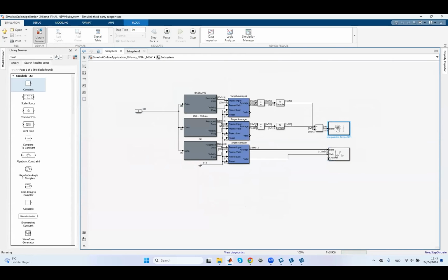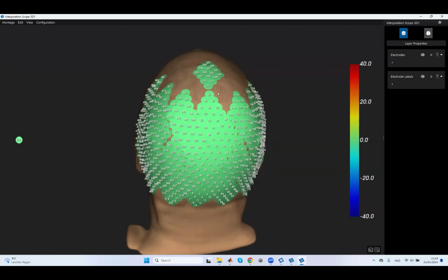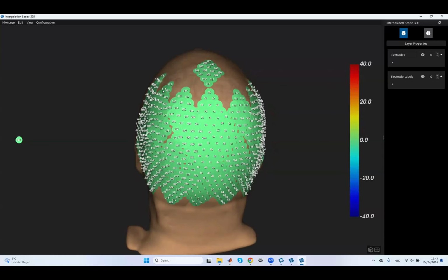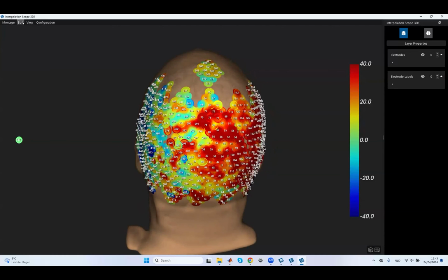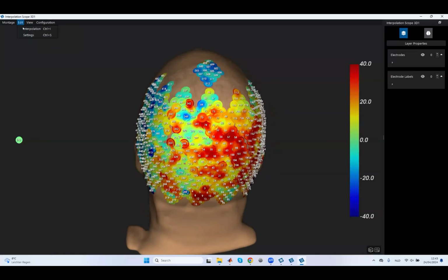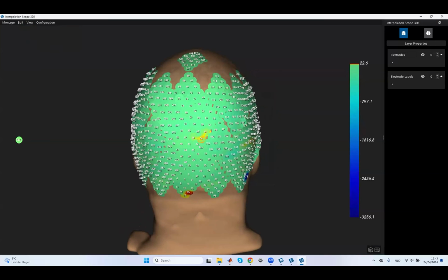And I think one question again is how much we'll be providing for a subject in EEG acquisition of a motor imagery task. Do you mean financial compensation, or what? I'm not sure. Or how much time?